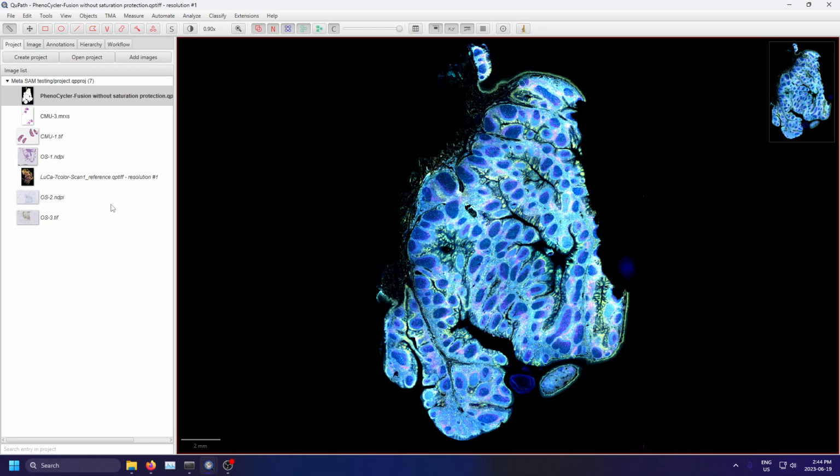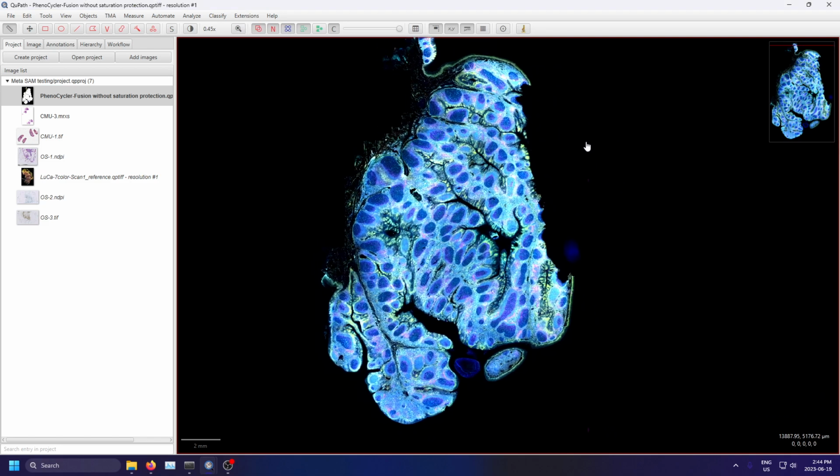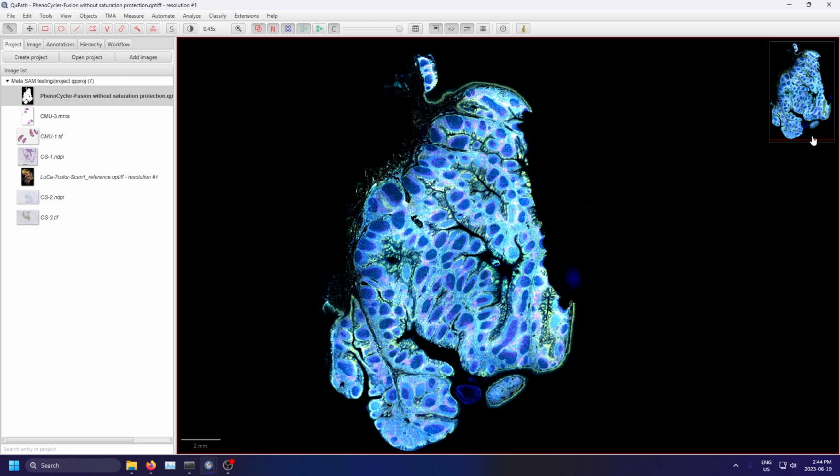So I'm going to demonstrate this on a few images I have, and most if not all of these are publicly available, just to see the kinds of segmentations we can get going. So of course the first thing you want to do is actually enable SAM, and it's very early on in the plugin's development, so you'll have to enable it every time you go over to a new image or even a new project. But let's give it a shot.